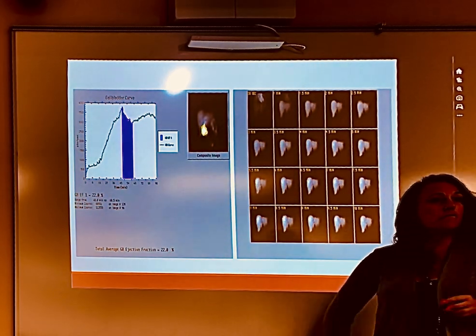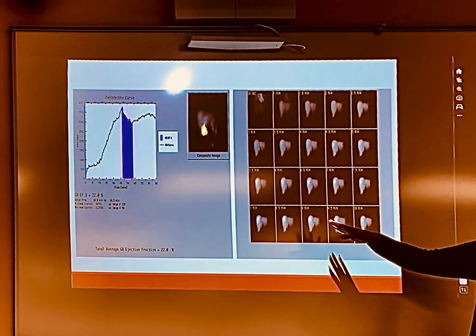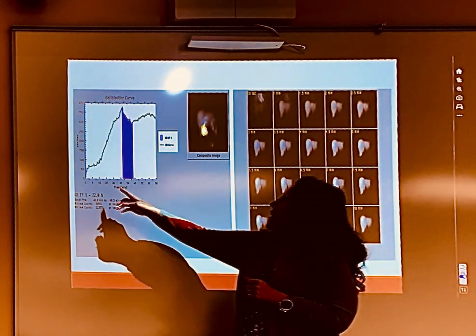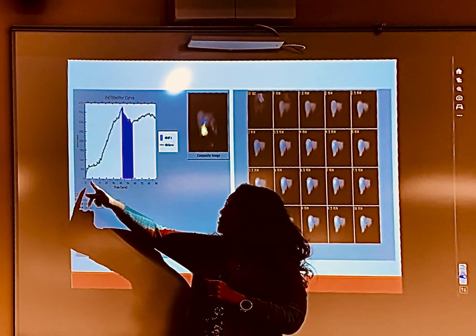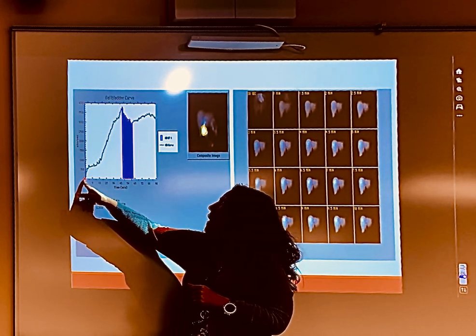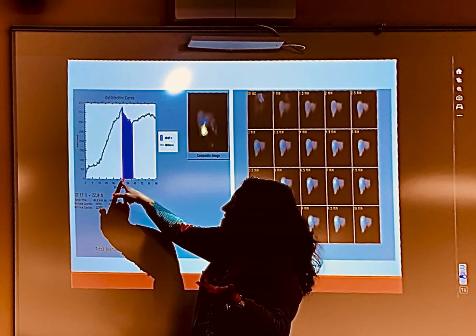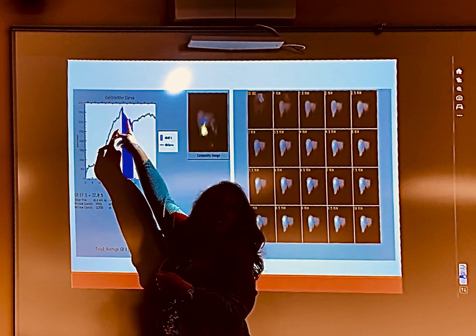Sorry, I have a question. So the curve going up is the gallbladder filling up, correct, and then down is empty. Right. So this was acquired dynamically the entire time. This was a 90-minute dynamic acquisition. So when they started the patient, your counts were 0. So this is your immediate picture. And then they waited until almost 60 minutes, 50, 45, we'll say 50 minutes. They saw everything, then they gave the CCK.